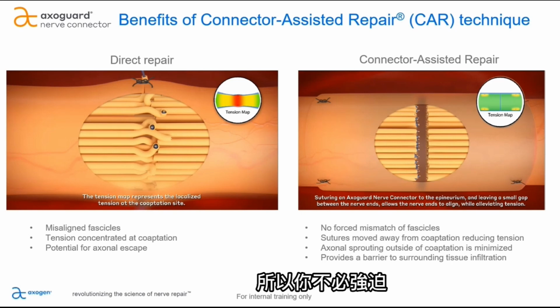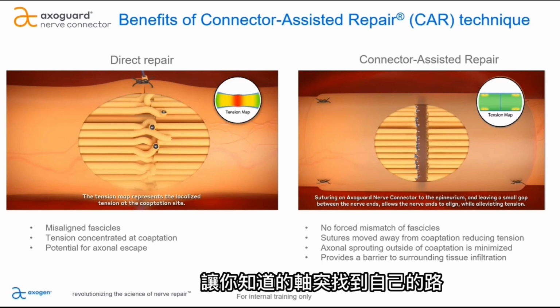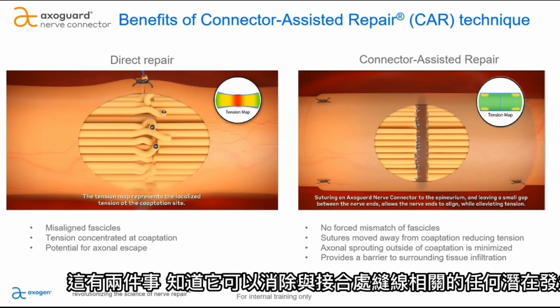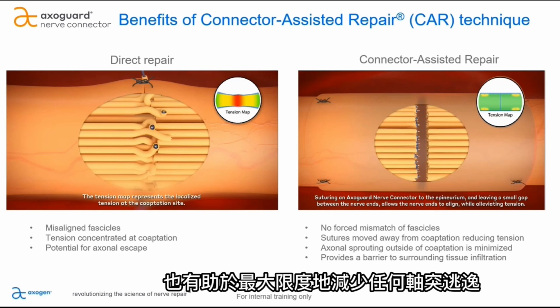So you don't have this forced mismatch of the fascicles. You can leave a small gap between the fascicles, or between the nerve ends, to allow the axons to find their own way. You can move your sutures away from the coaptation to the edge of the conduit, and that does two things. It removes any potential inflammation related to those sutures away from your coaptation, and it also helps to relieve tension at that coaptation. And then having the connector-assisted repair helps to prevent infiltration from surrounding tissue, and also helps to minimize any axonal escape.